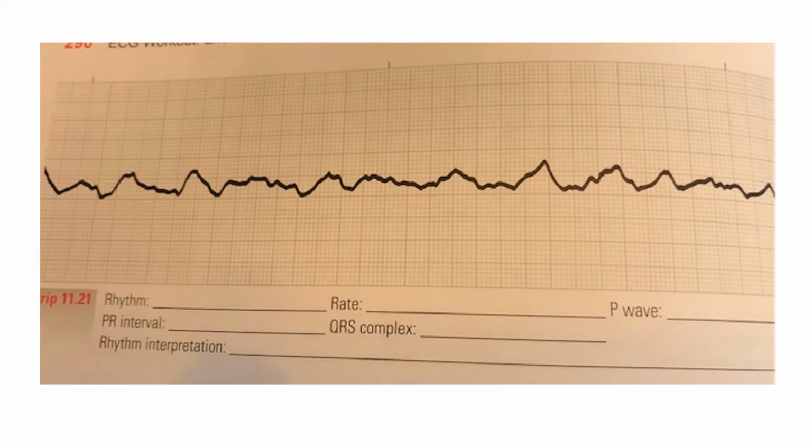As soon as you see it, you want immediate defibrillation along with CPR. So if you can, call for help for somebody else to get the defibrillator, and you're going to start CPR. Your CAB is going to be first. You've already checked that there's no pulse and that they're not breathing, so you're doing CPR. As soon as the defibrillator comes, you defibrillate as soon as possible, and resume CPR. You're going to do CPR for 2 minutes. After 2 minutes, if you're still in Vfib, you're going to defib again.